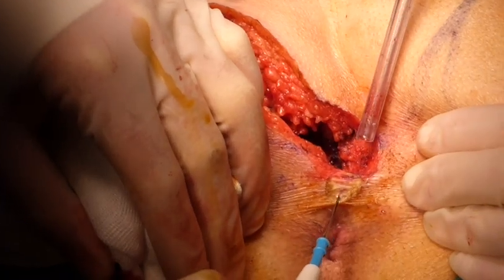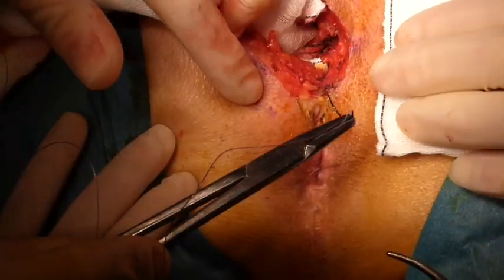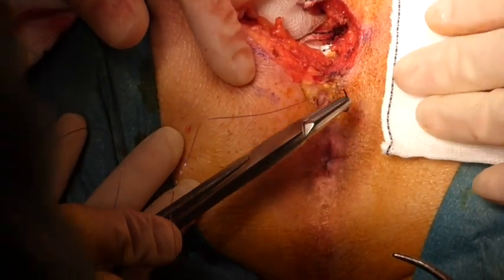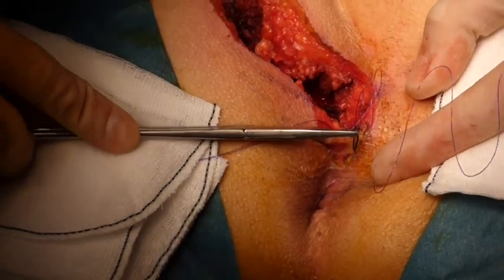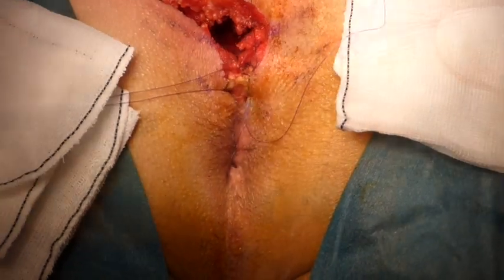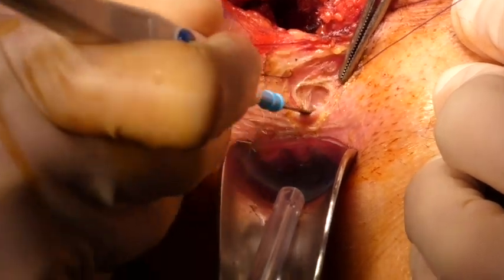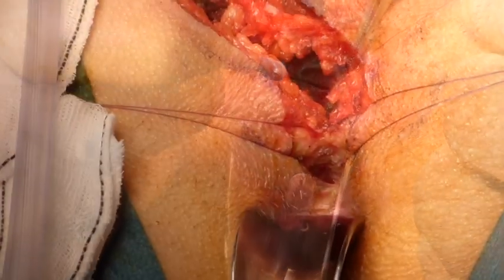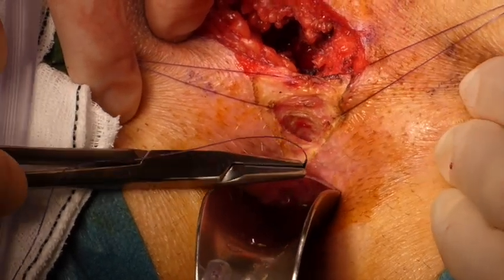The anal sphincter is then divided by layers and absorbable sutures are placed at this time to provide proper alignment of the segments of the sphincter at closure. We separate the internal sphincter from the external sphincter and reference both of them with some more stitches.